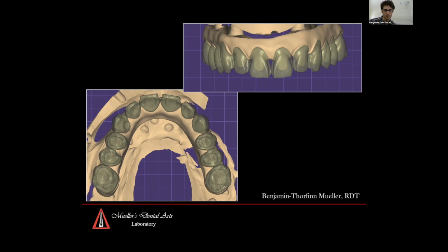The wizard does a great job in ExoCAD of finding that margin, and with proper order creation setup of the anatomic wax-up, you can just merge the design of your diagnostic setup to the crown, and everything's basically ready to rock and roll. For her, I then ended up doing a custom cutback because she requested higher aesthetics in the anterior 6.